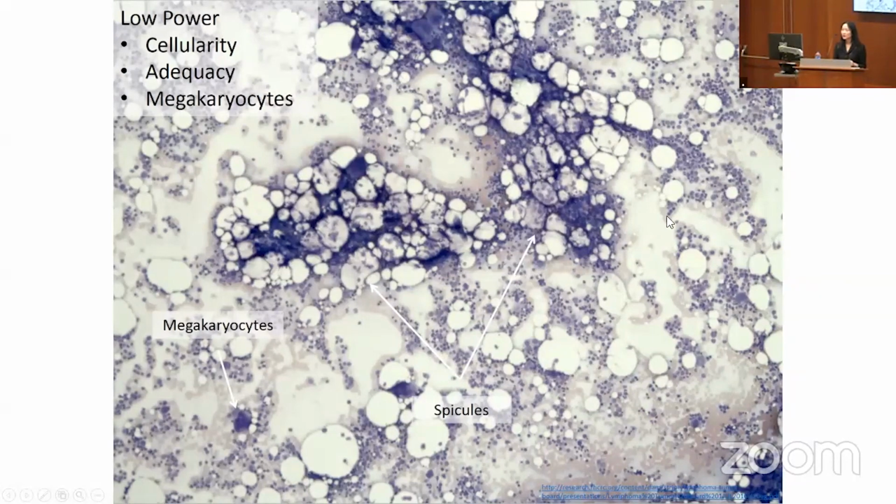So when we do our 500 cell count, we're going to go over here, because that is as close to the marrow. But here you can't really count because you can't see anything. It's just doubled up on each other. You can see also the fat of the spicule.